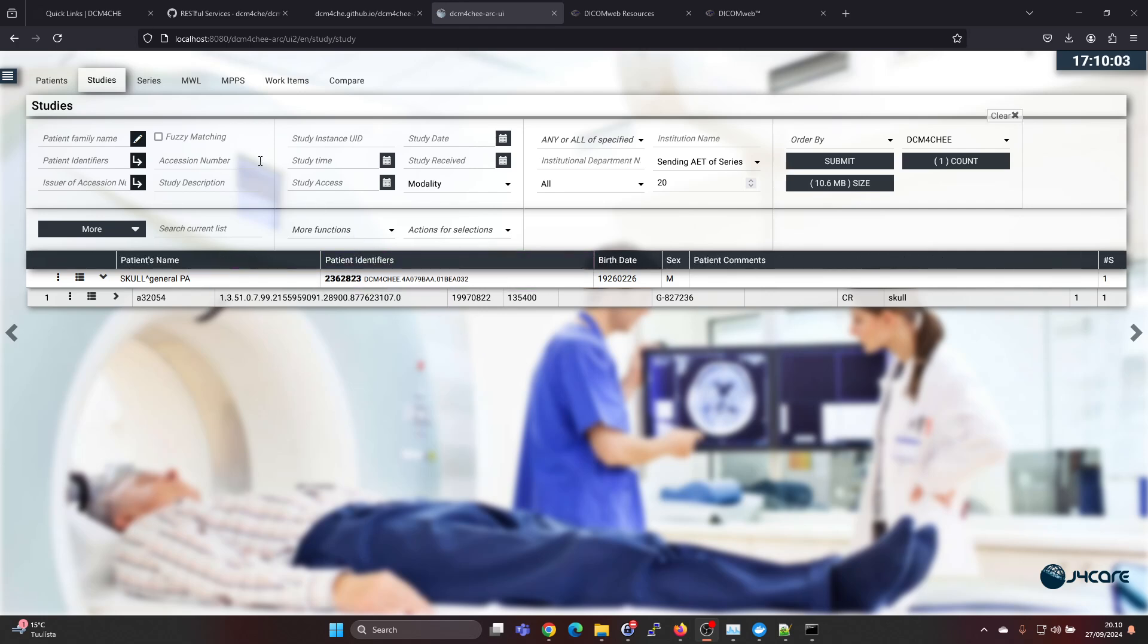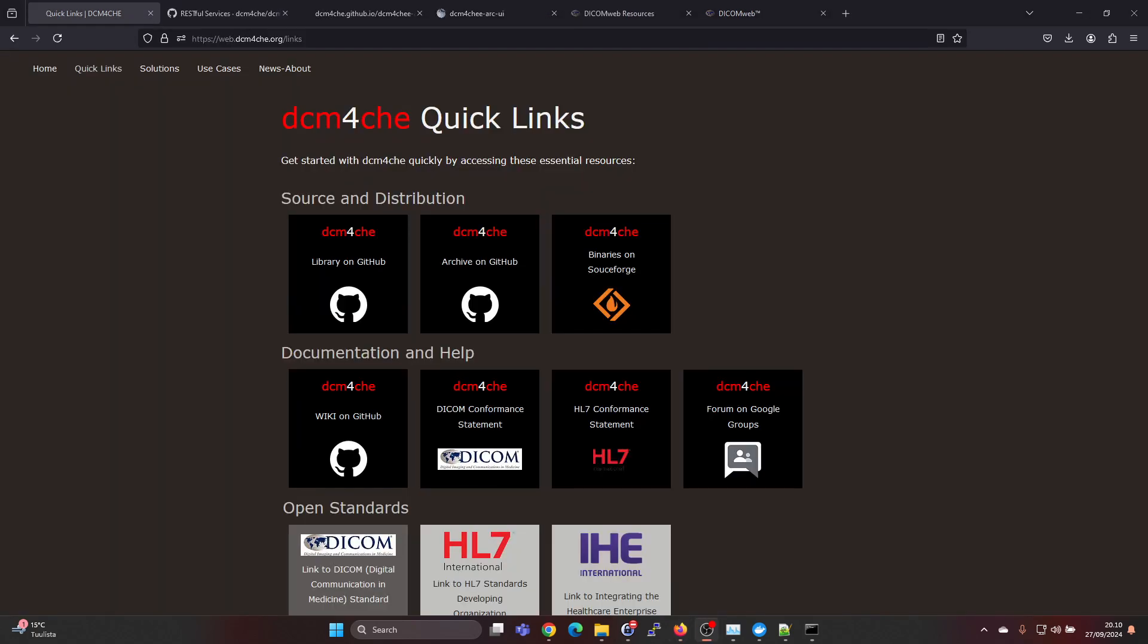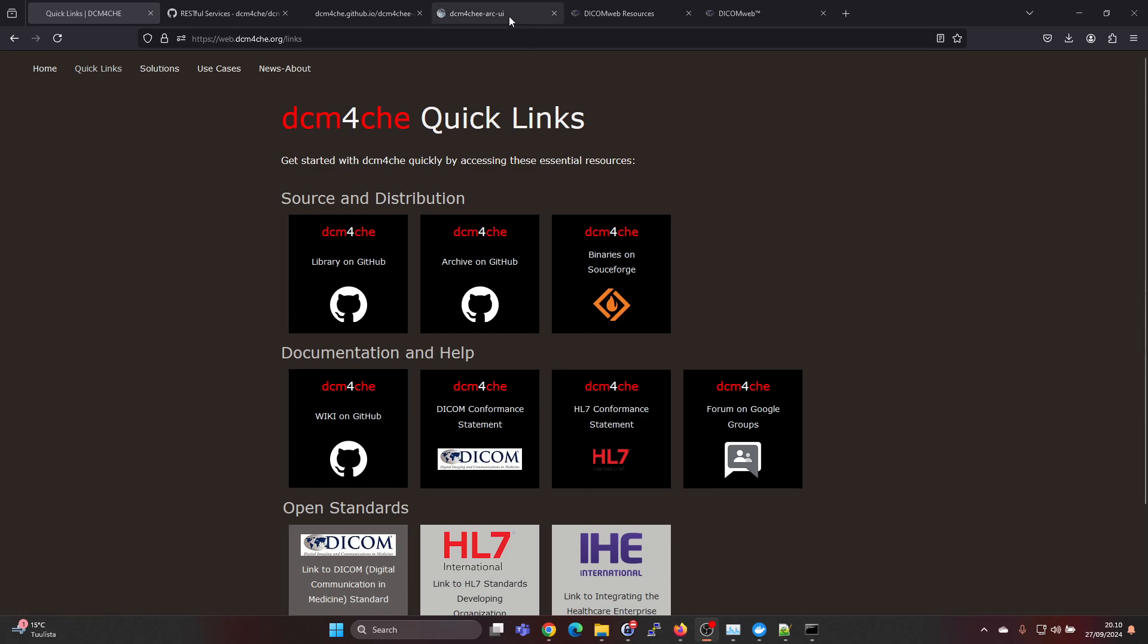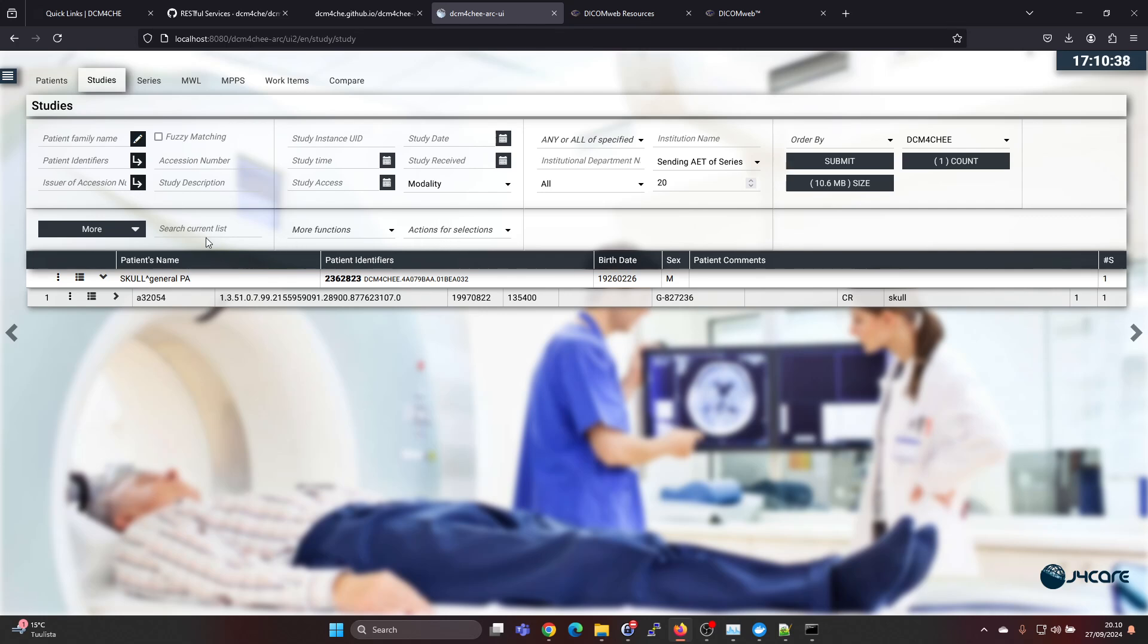A good option for this is the Dicom4ChE archive 5. This is an open source Dicom archive or PACS or VNA, whatever you want to call it, and it has very good capabilities. If you want to install this for testing, check out the link in the video description for my video on getting it installed.